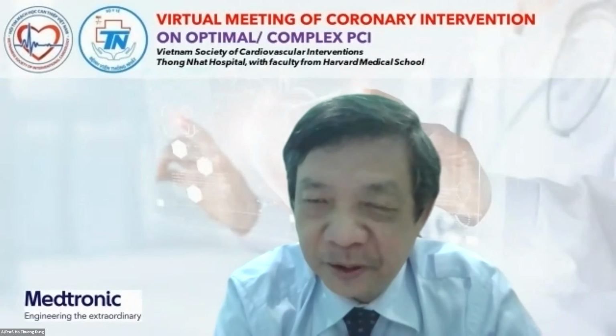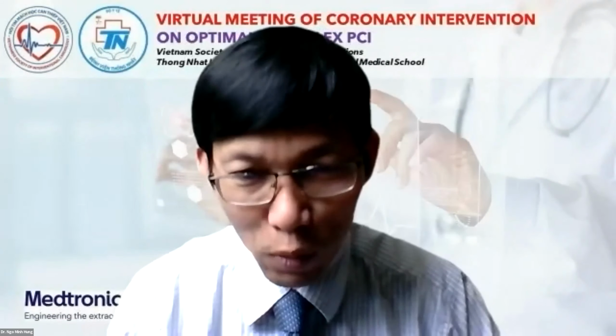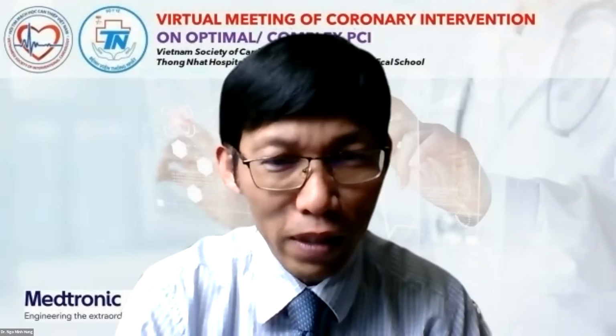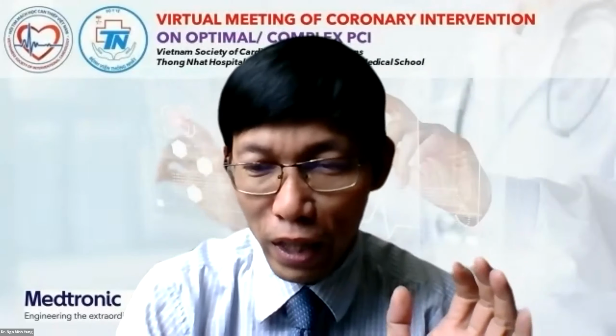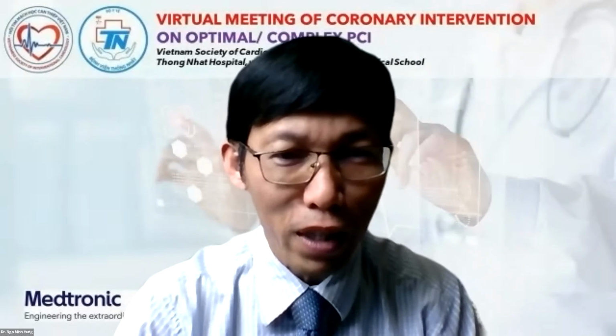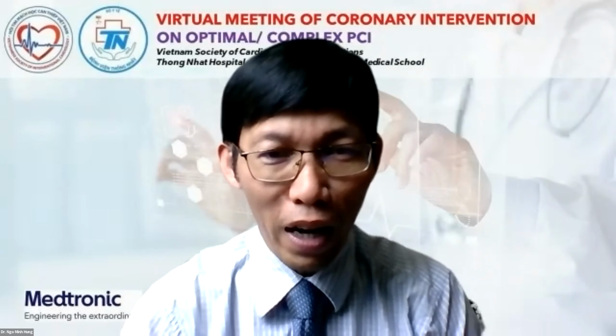You can open the microphone. Yeah, thank you very much, Professor Dũng. I just had a short question for Professor Thạch, that I love this theory. Dr. Kumar just mentioned how we apply that in the future. So I think Professor Thạch is going to present about the software, the deep learning, how to calculate the laminar flow, and for example virtual stenting. Is this correct, Professor Thạch?